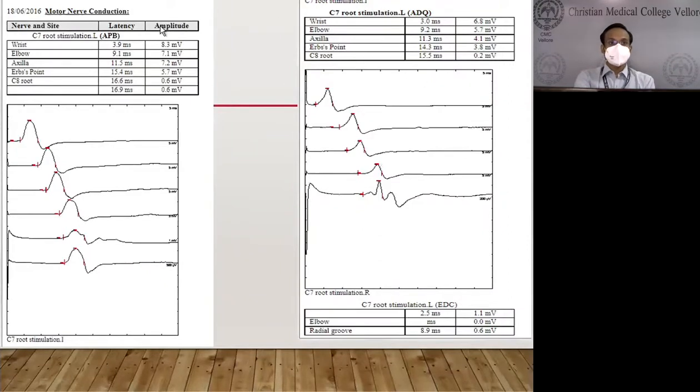So first, his ganglioside antibodies were negative. CSF was. What's the last one in the? So this is the radial. The last one was almost normal. Yes, sir. So this is at 1 millivolt, and this is at 500 microvolt. He has changed the display setting. It's the same, the gain is different. 1 millivolt is 500. So it's the same low amplitude motor.